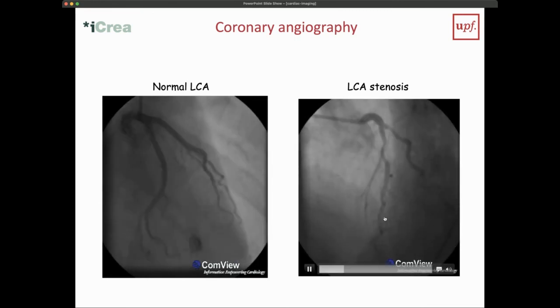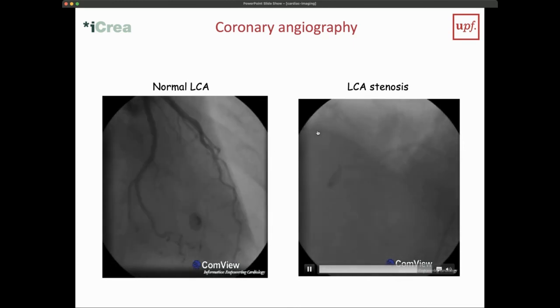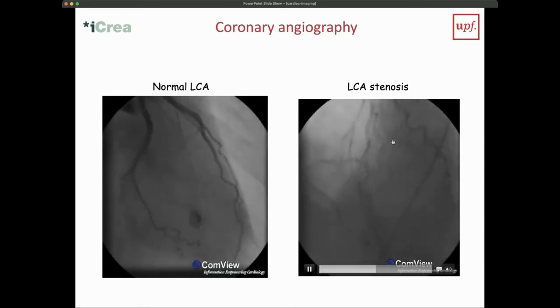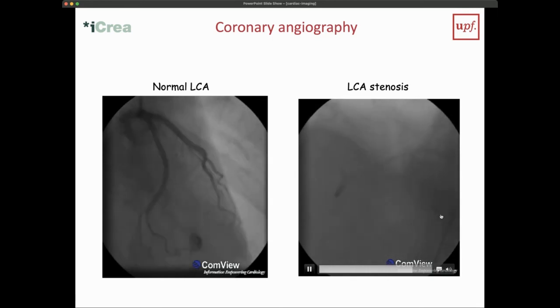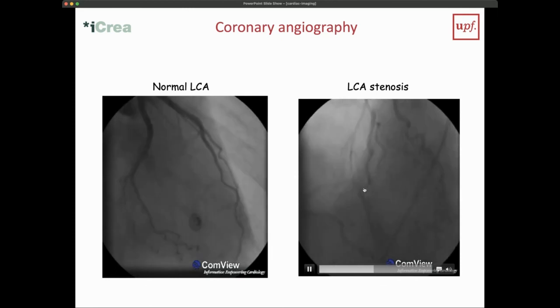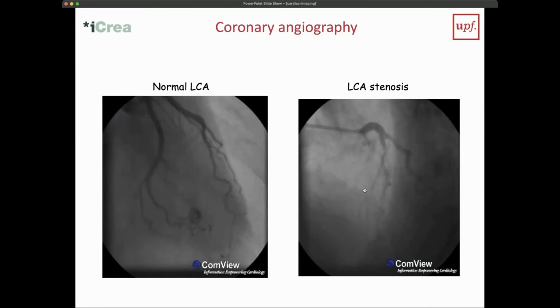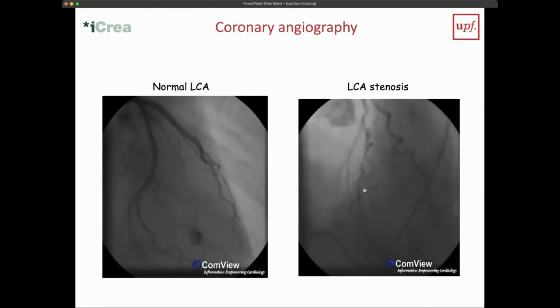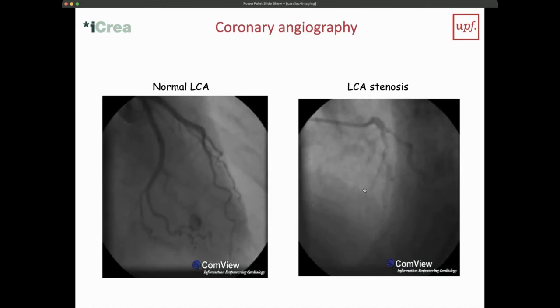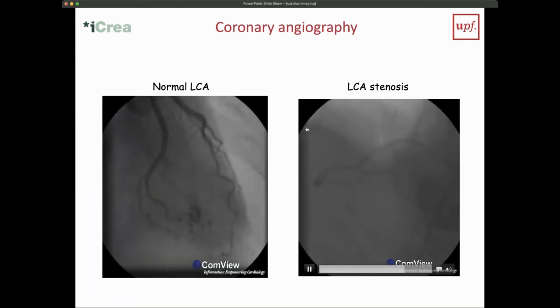And what this actually is, is a patient who has a fully occluded right coronary artery. And this patient is lucky enough that the left coronary artery is actually connected to the right coronary artery and can fill it with blood retrogradely. So this is what we call collateral circulation, which is extremely rare in patients, because I told you before, in most patients, one coronary artery is not connected to the other, and that means that if one occludes, the patient gets a big infarct. But this patient was lucky because the right coronary artery is fully occluded.